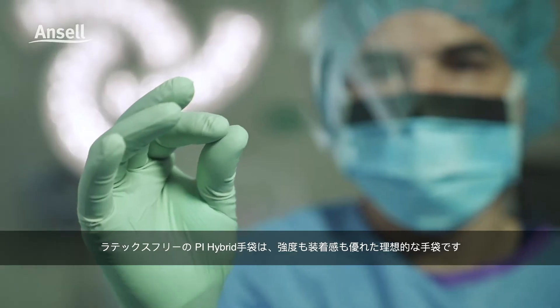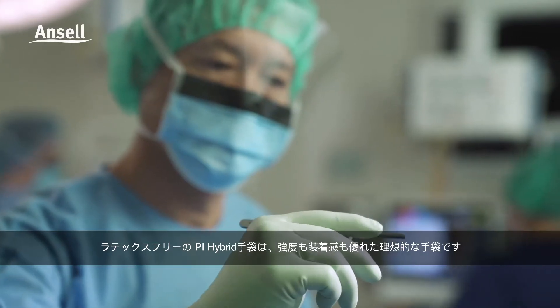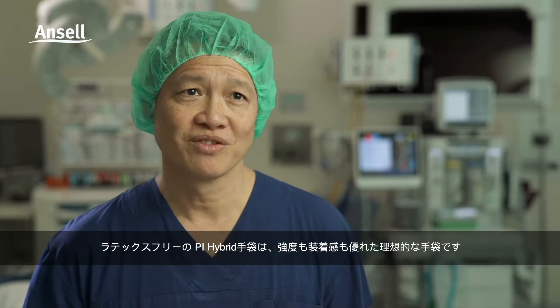A non-latex PI hybrid glove that combines the strength I need with the comfort I want. Well, that works for me.